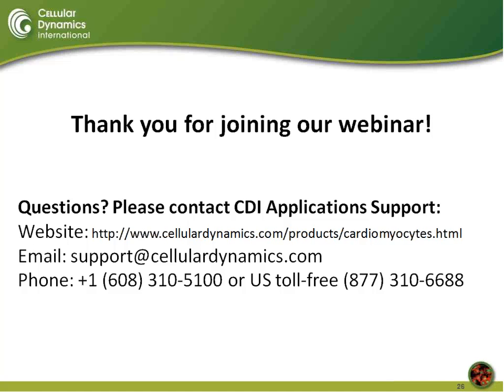All right, final question that we have is, how long can these neurons survive in culture in our hands? Again, as I just spoke to a moment ago, we do all of our functionality testing typically within 3 weeks of culture. However, we have taken them out much longer and maintained nice viable cultures for several months. We do have some customers who have looked at longer-term assays as well, taking them out 5-6 weeks in culture. So the cells, with a regular feeding schedule of every 3 to 5 days, can be maintained indefinitely, so you shouldn't have any problems taking them out for longer term.